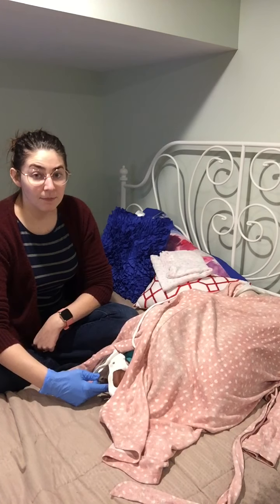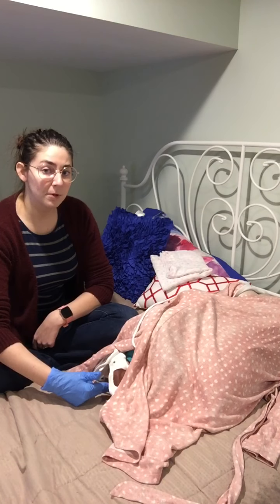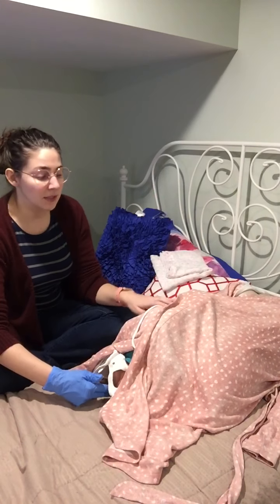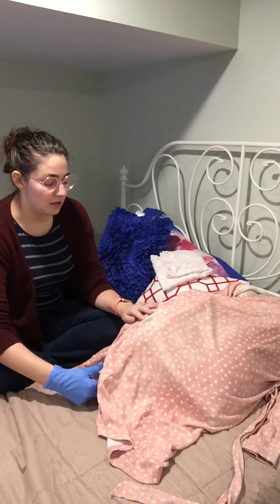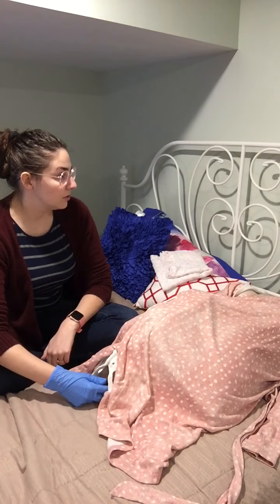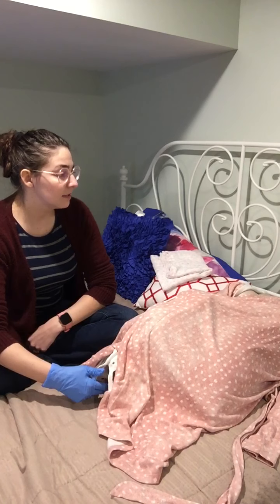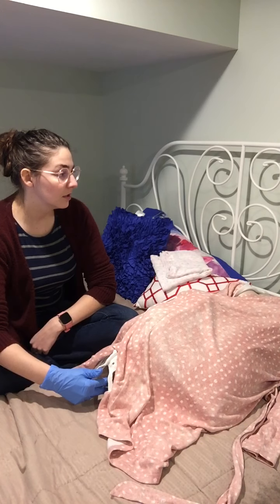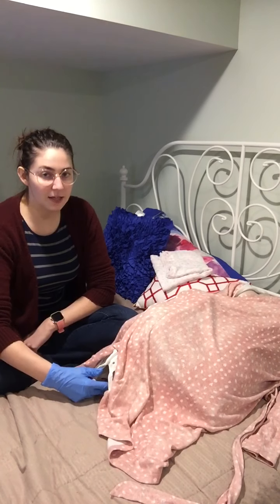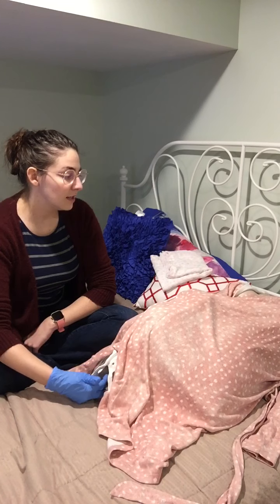The cervix is very thin. Baby is already low, and if I apply a little bit of pressure, I feel that she is engaged — she's not floating back up into the belly, so that's good. Feeling how thin the cervix is, I'll give her 100% effacement but only 7 cm dilated so far.